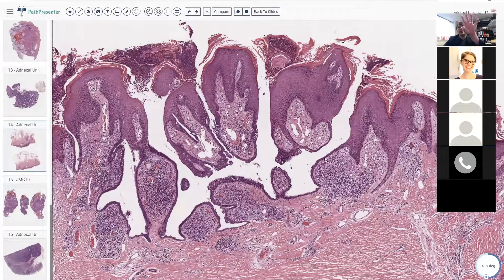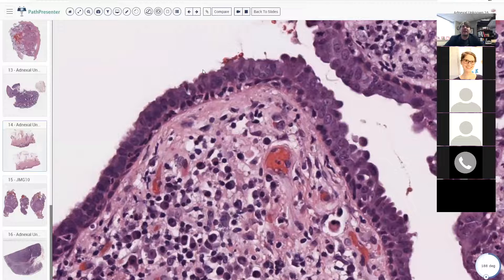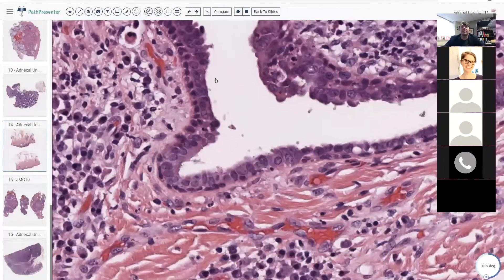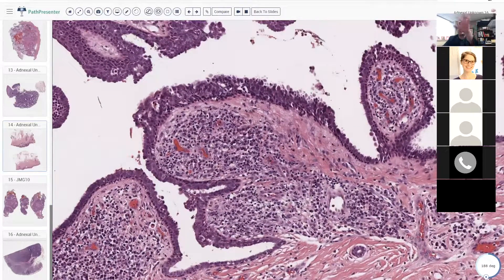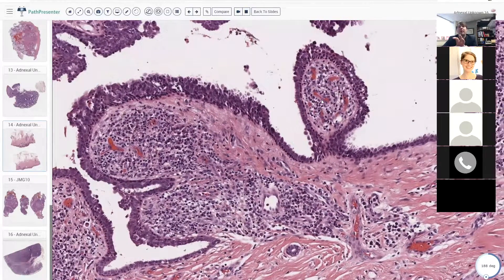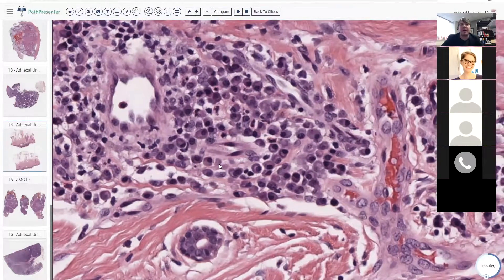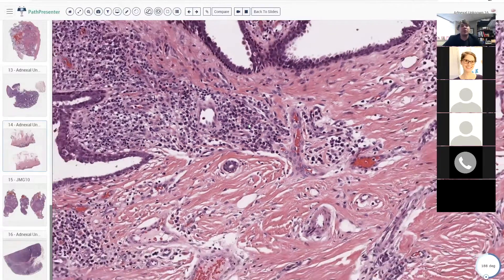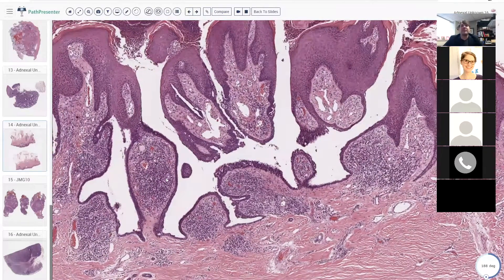Syringocystadenoma papilliferum has these invaginating channels that come down and push into the dermis. They're lined by a double layer of columnar or cuboidal cells that often have little apocrine snouting on the surface — a little basal layer and then a little apical layer with little snouts. Then there are bulging papillae that come into the lumen of these spaces, and in the stroma of these papillae you're going to have tons of plasma cells. Not exactly sure why plasma cells like this lesion so much, but they really do — they're usually present.